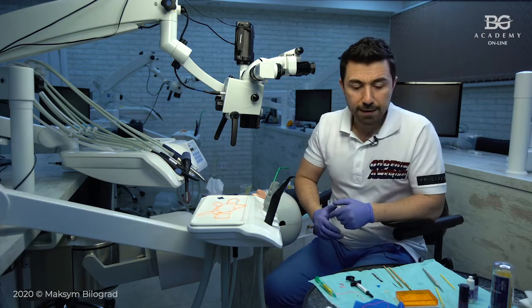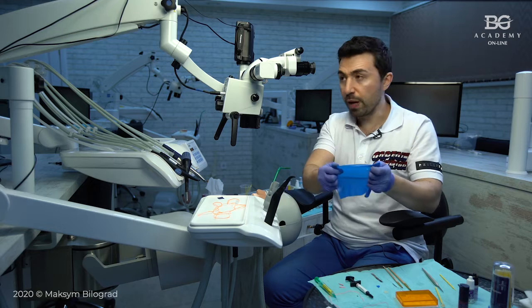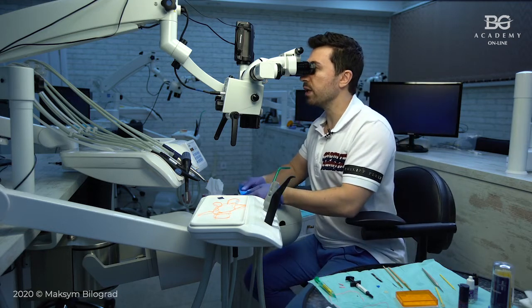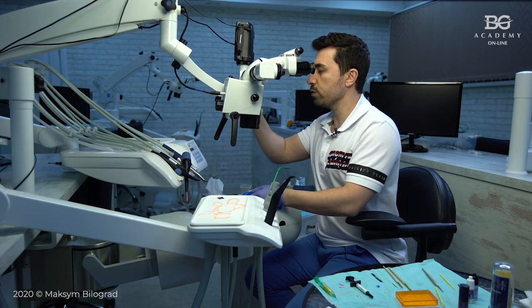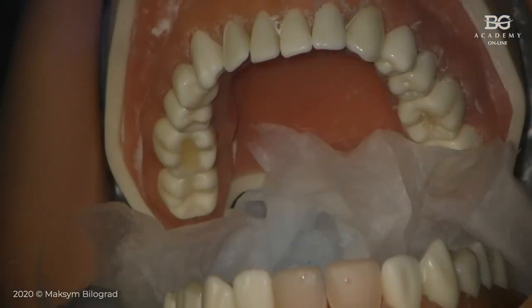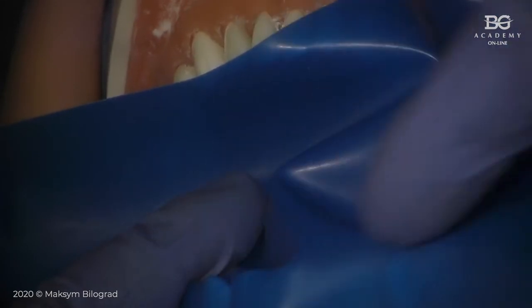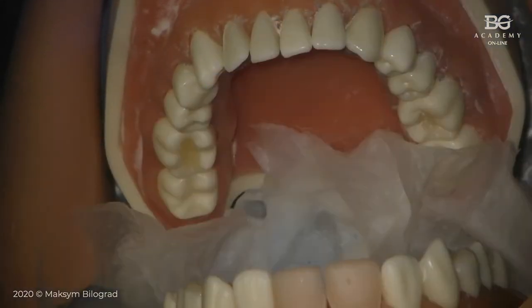I will just do the isolation, and then I will show you some tips related to rubber dam isolation and the cementation process. For example, to make these perforations, let me show you in the microscope camera also. I mean preparations for perforations for teeth. We may use several methods. One of the methods is just to use a template, or you can put your rubber dam on the tooth surface and make customized marks. Your assistant makes customized marks, then you just perforate them.